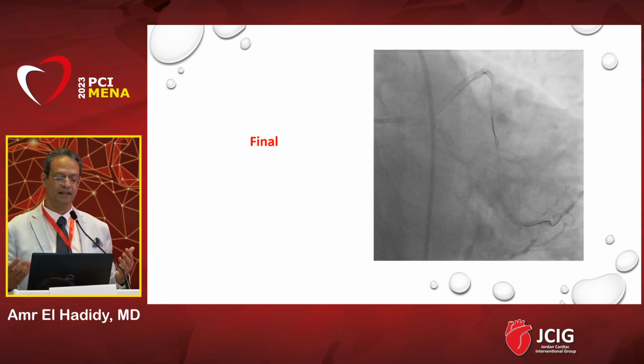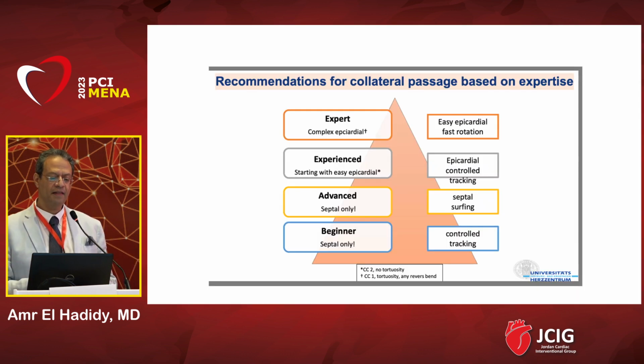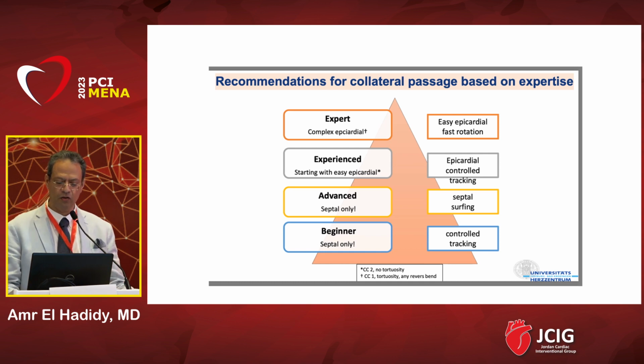and definitely we sometimes need to try antegrade, but sometimes you cannot. It is better to try surfing in retrograde, and retrograde wire escalation. Heart team discussion is very important.